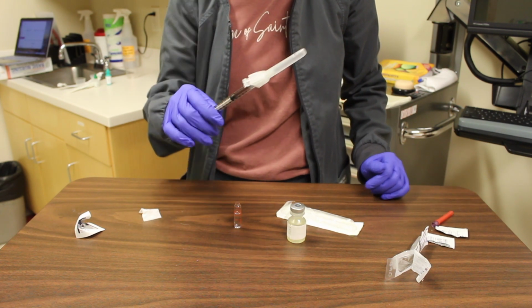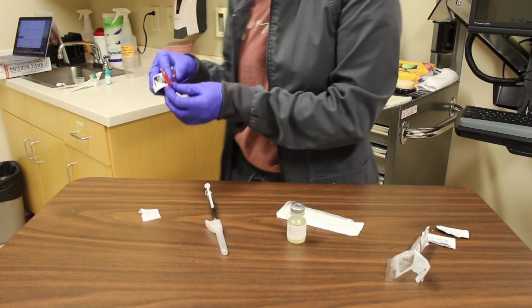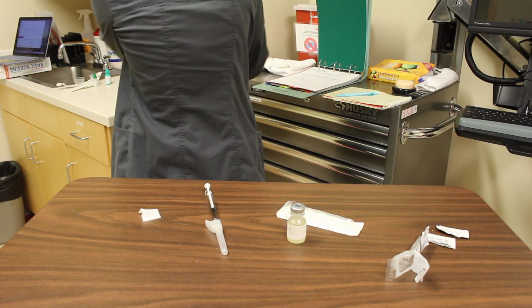Dispose of the ampule pieces and filter needle into the sharps container. Document the administration of this medication and complete your ending 4.